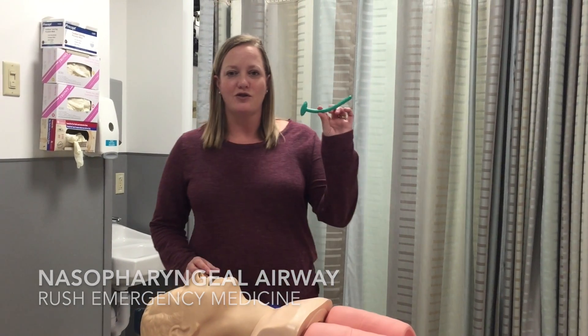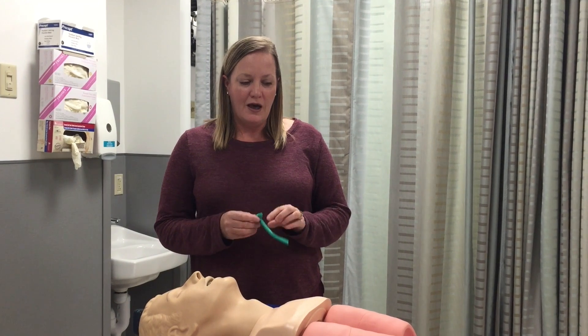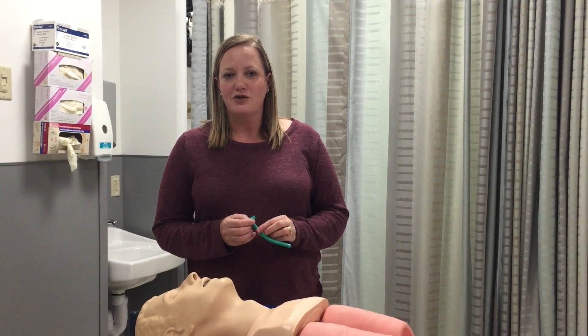The first thing we're going to look at is something called a nasopharyngeal airway. This is a soft, flexible rubber tube, and it's meant to kind of open the airway in patients who are a little bit obtunded. Our most common indication for this would be maybe an intoxicated patient who just needs a little bit of airway assistance.